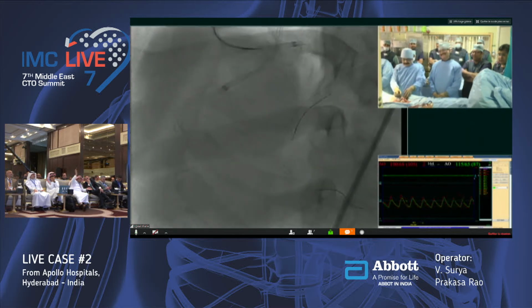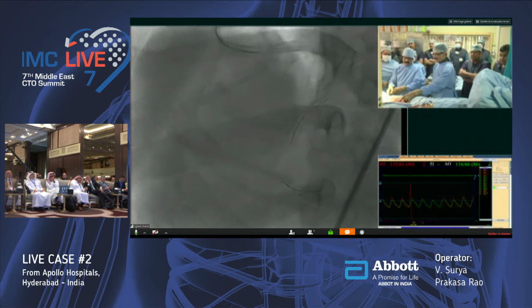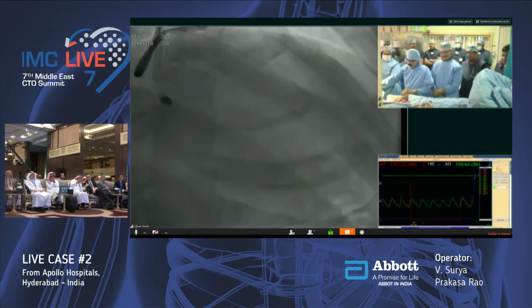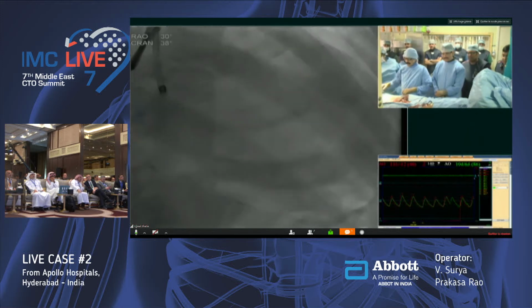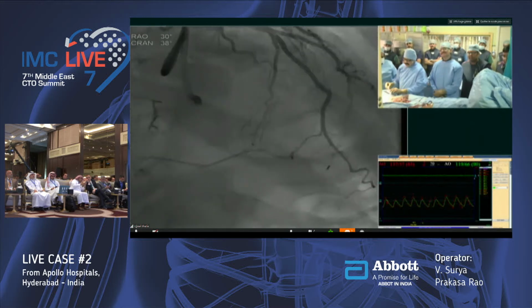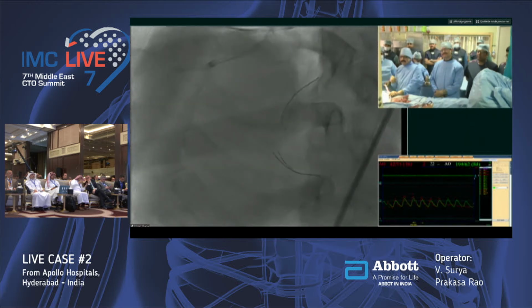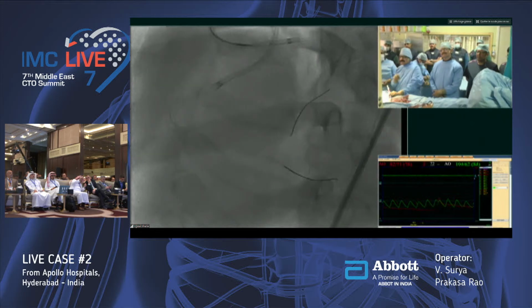So we saw the diagnostic angio, and it's in-stent occlusion. Does the stent go close to the crux, because we're not sure about that? Yes, exactly. Just beyond the bifurcation. We lost the PLV in the ISR. It is retrogradely filling from the left system. The PD, just beyond the bifurcation, is filling.